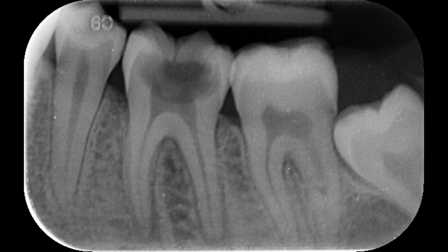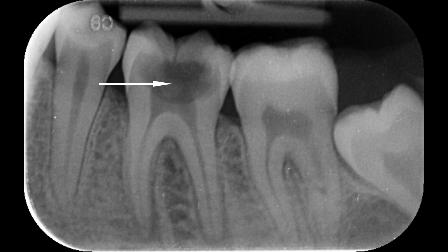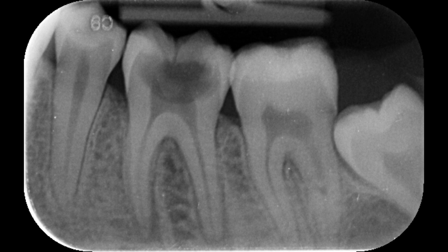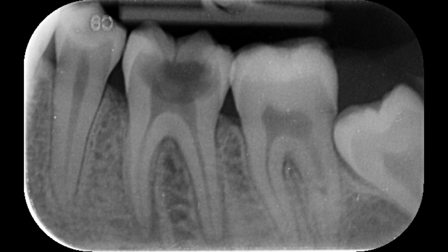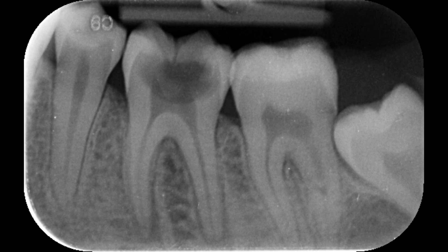Let's have a look at the preoperative radiograph of the patient, where you can see that the decay has involved the pulp. The pulp canals are very wide, so the root canal is not going to be very difficult, but the most important consideration is that there might be a lot of bleeding from this inflammatory pulp. I identified all four canals in this tooth and cleaned and shaped them very well.